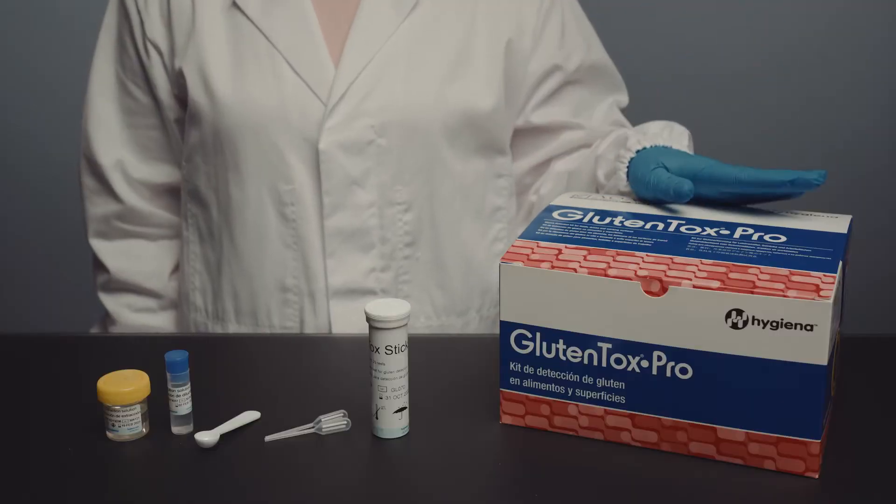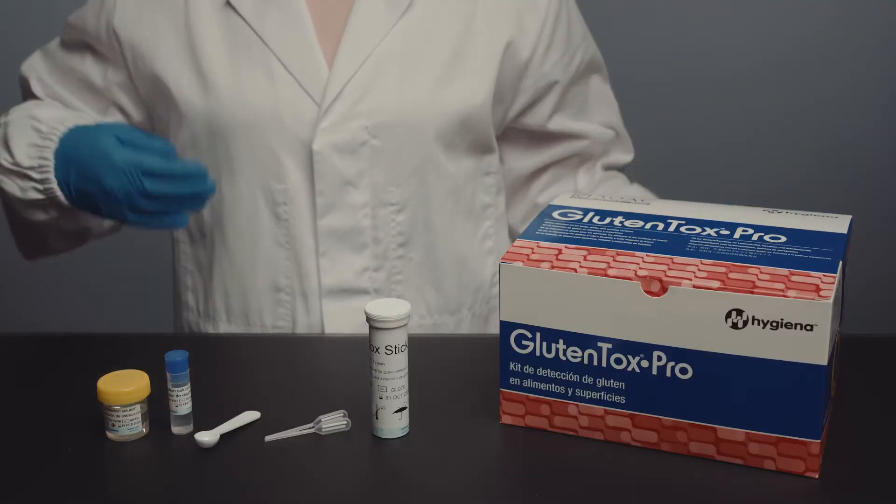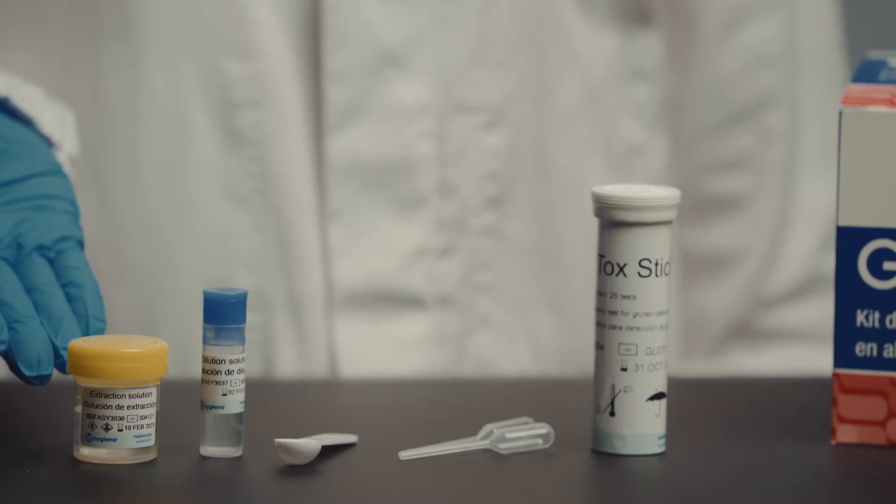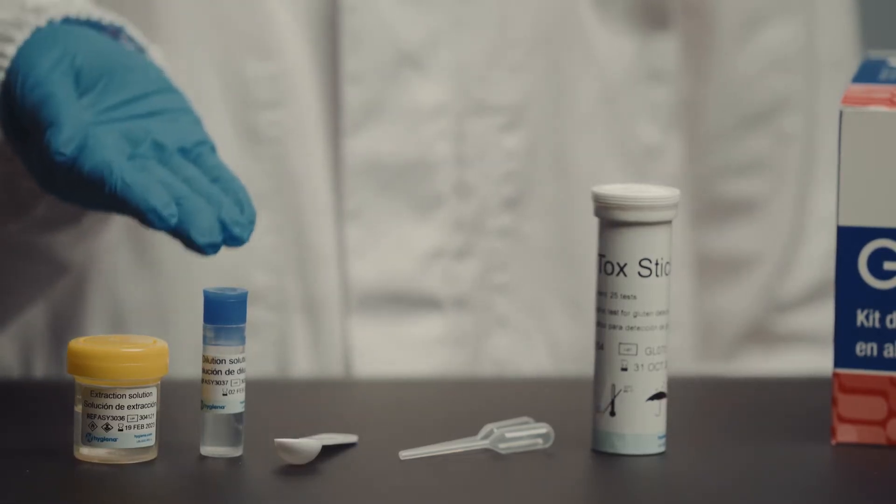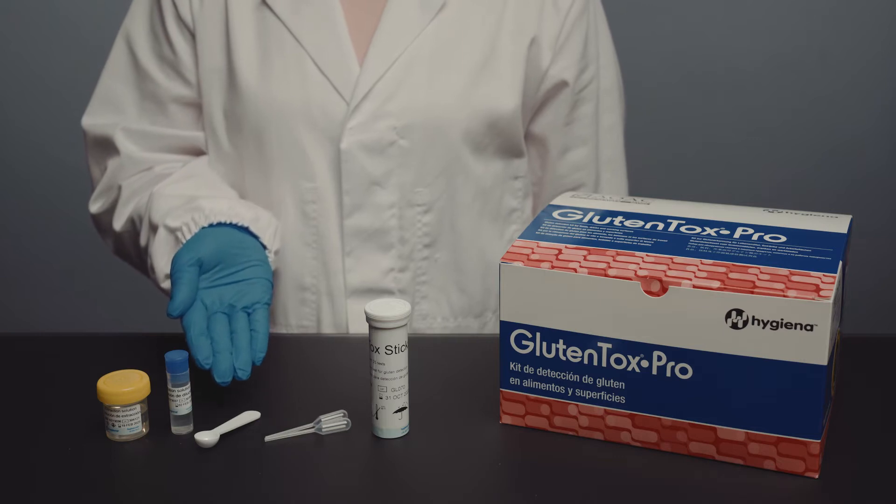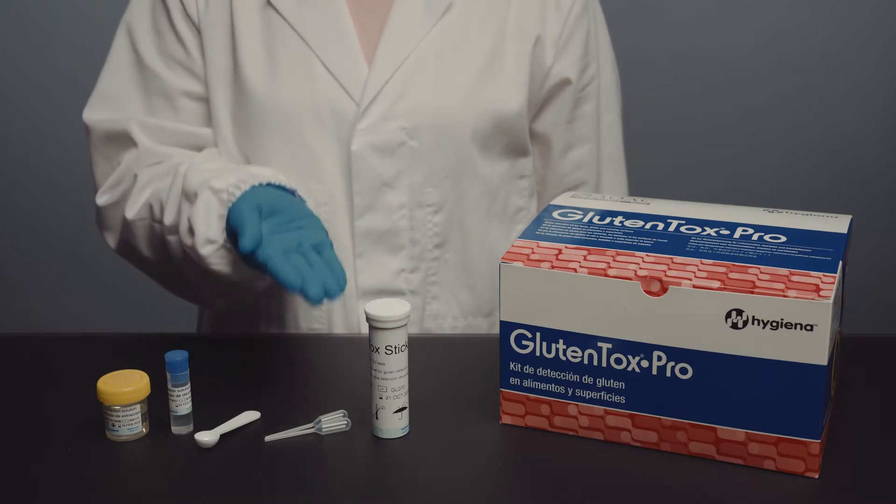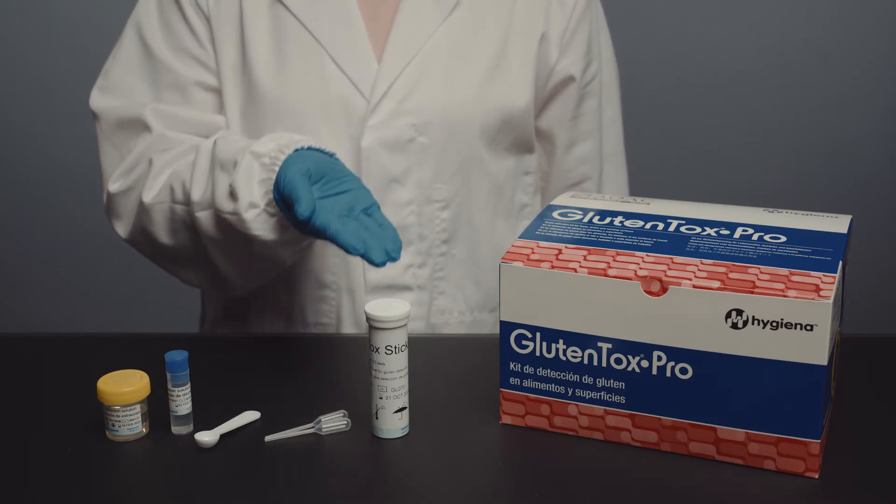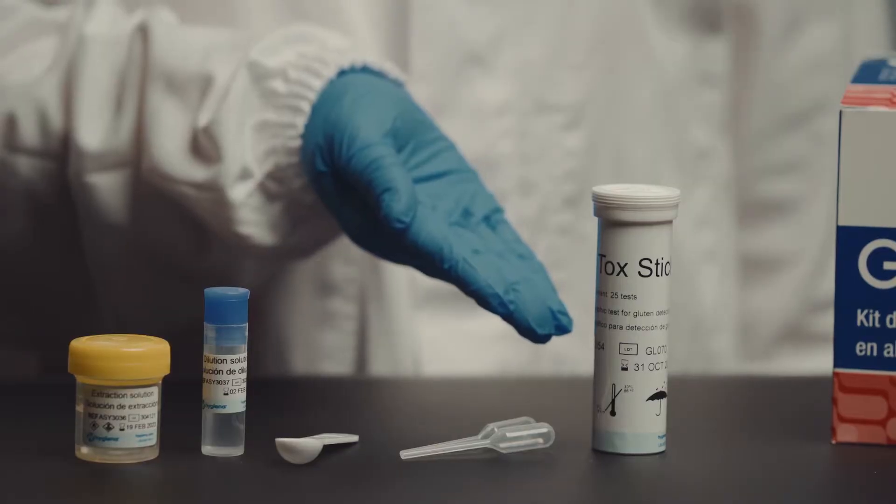Step two, remove the following components from the box: one extraction buffer, a bottle with a yellow cap, one dilution buffer, a bottle with a blue cap, one disposable scoop, two disposable pipettes, and the tube that contains the Gluten ToxPro strips.